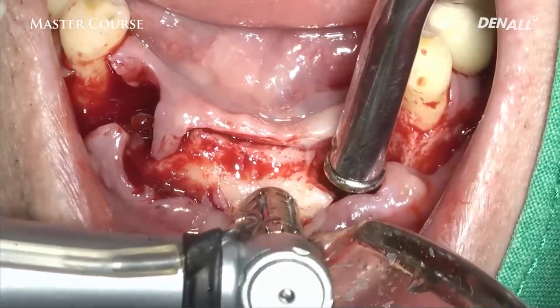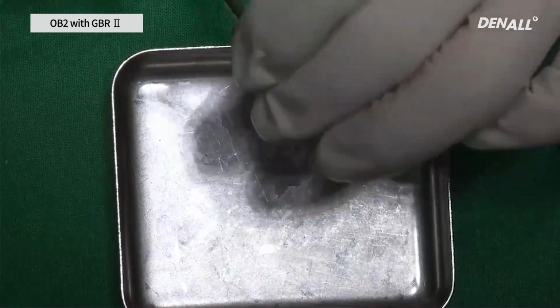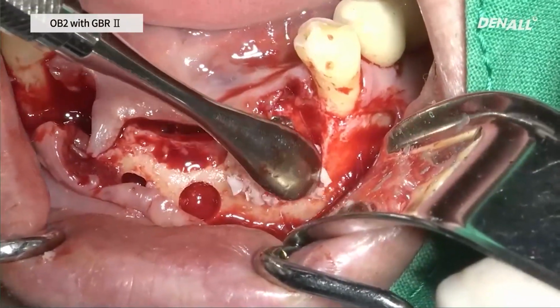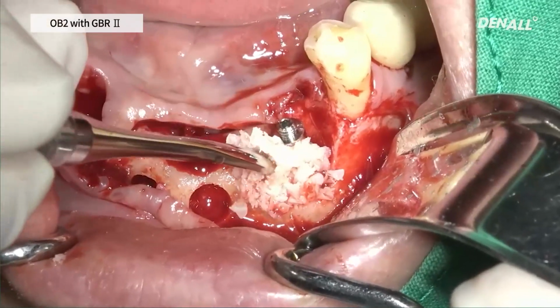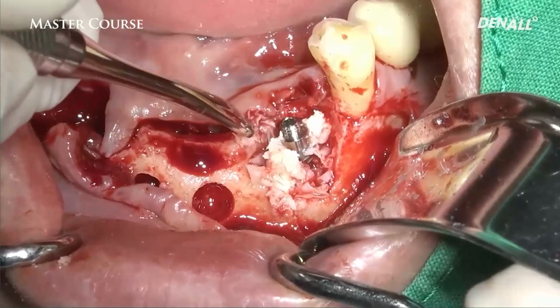Sandwich technique was chosen. From the symphysis area, autogenous bone was grafted using autobone collector, which is a drill dedicated for autogenous bone grafting. I used autogenous bone and xenograft to do sandwich technique.